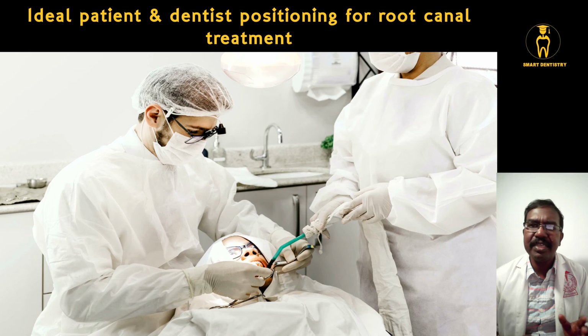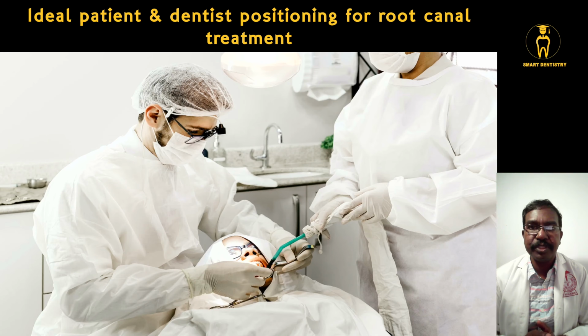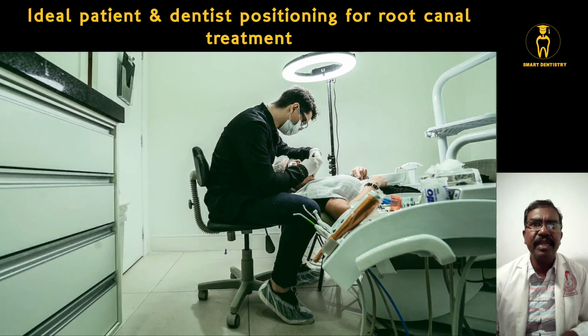Maybe for a couple of weeks it may be a little difficult, but once you get used to the position, all the 32 teeth in the oral cavity can be easily accessed by sitting in the 11 o'clock position. This will also give a clear vision even for the maxillary teeth in the mirror. So the 11 o'clock position and flat positioning of the patient are very essential.